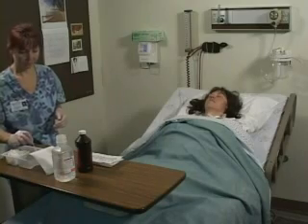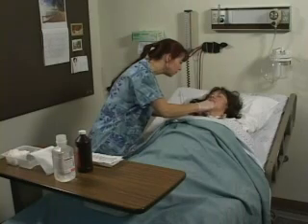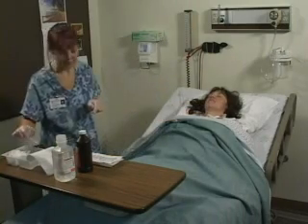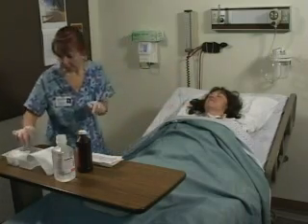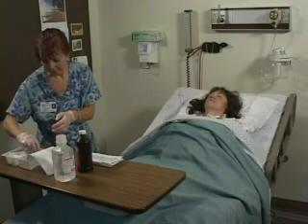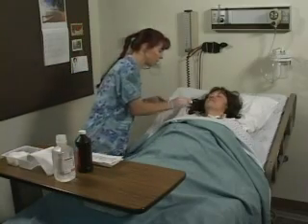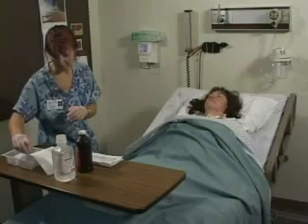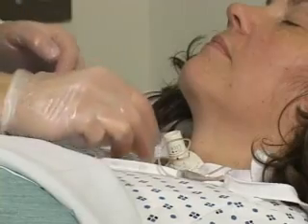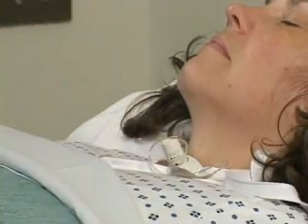Cleanse around the neck plate with cotton applicators that have been moistened with sterile saline, hydrogen peroxide, or other approved antiseptic solution. Repeat this procedure by rinsing the skin around the neck plate. Avoid dripping liquids into the tracheostomy opening to prevent aspiration, while providing a thorough cleansing of the neck plate. Wipe only once with each pad and discard it in order to prevent contamination of a clean area with a soiled pad. Repeat the same cleansing procedure under the neck plate, on the skin of the client. Be sure to use cotton applicators to dry the skin under the neck plate to prevent skin irritation or breakdown.